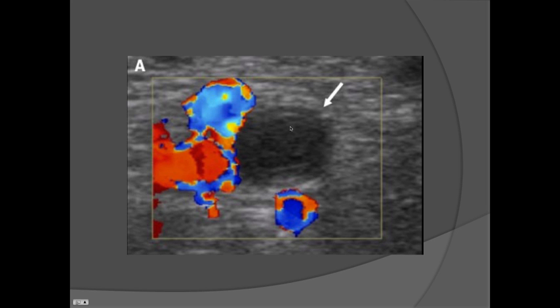This is what you might see if there was some occlusion within the vessel there. So you see here some patency and some smaller veins here, maybe the artery here with the red, and then in this huge vessel here, there's no flow going on that we can see with the Doppler. So that might clue us into the possible presence of a venous thrombosis within that vessel.